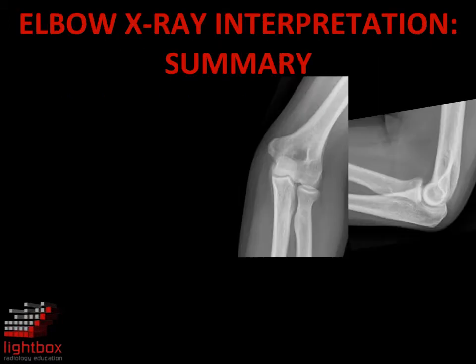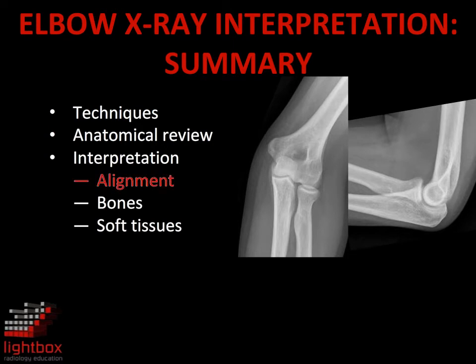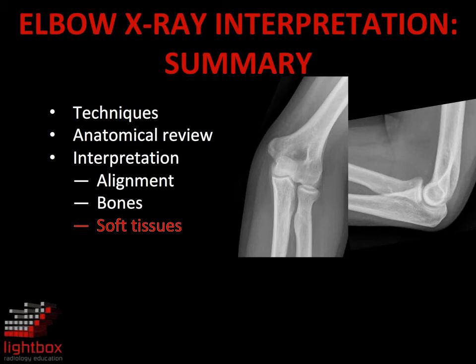This concludes our module on elbow x-ray interpretation. We've reviewed normal x-ray techniques and anatomy. In summary, x-ray interpretation of the elbow involves assessment of alignment, bones, and soft tissues. The radiocapitellar line and anterior humeral line are used to assess alignment. The most common injuries in the paediatric population are supracondylar fractures, followed by lateral condylar fractures. In adults, the most common injuries are radial head fractures, followed by coronoid process fractures. In assessment of the soft tissues, it is important to look for fat pad signs of a haemarthrosis, which may be the only sign of an occult fracture of the elbow.